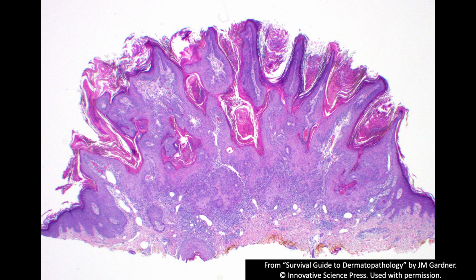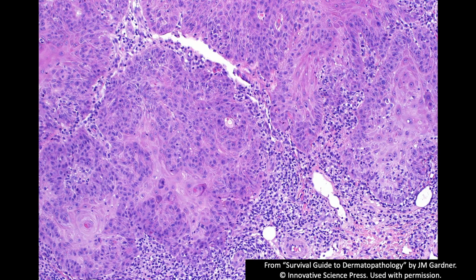And even though there's no obvious atypia here, the lesion's broadly transected, and if it continues to grow, if it persists or recurs, then I'd go back and biopsy it or excise it. So sometimes I hedge on things where I can't see the base of a keratinocytic lesion in sun-damaged skin, and I always like to point cases like this out to my residents in dermatology to show them this is why I hedge, because these kinds of cases can really be tricky.